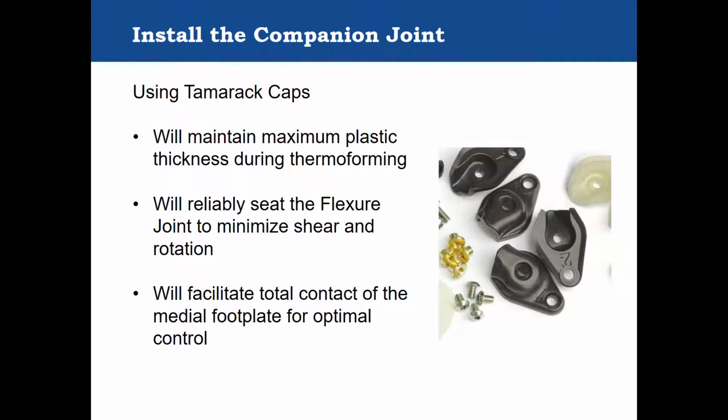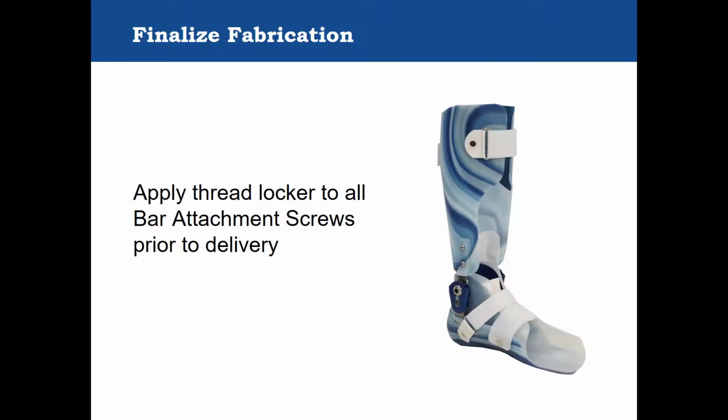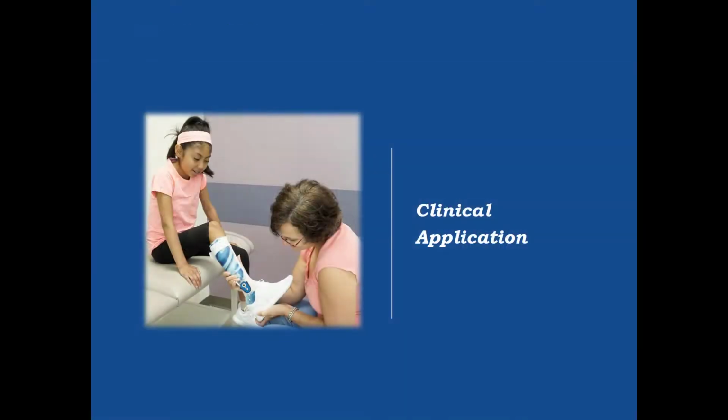Tamarack caps improve AFO stiffness and minimize joint motion while improving the control of total contact footplates. Be sure to apply thread-locking adhesive to all bar attachment screws to finalize fabrication. Tuning a triple action AFO is faster and easier than you may think. This section takes you step by step through the clinical application of a triple action AFO, including the tuning procedure to help you achieve the optimal outcome for your patient.